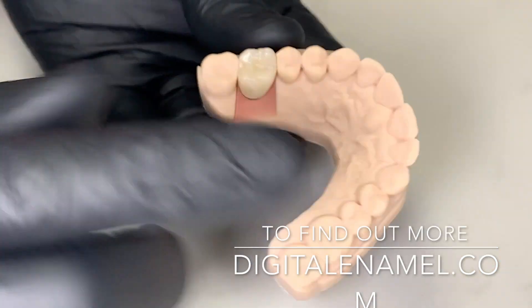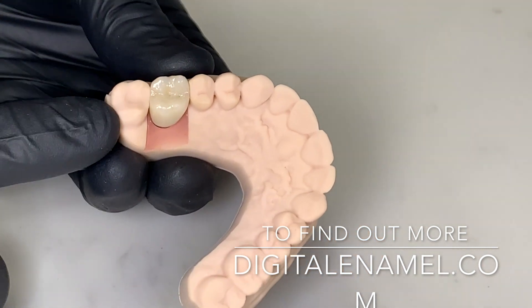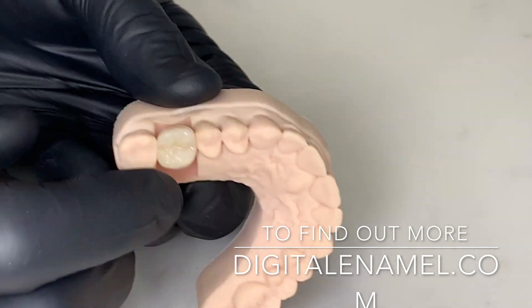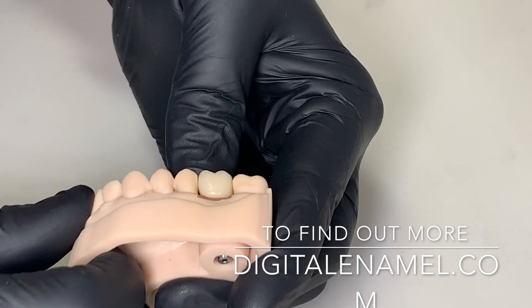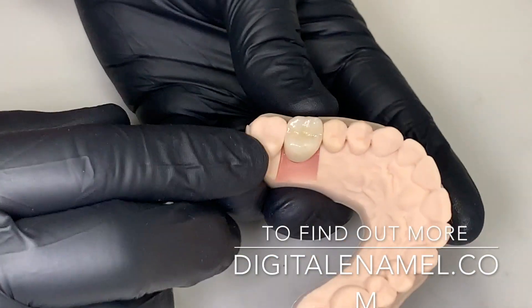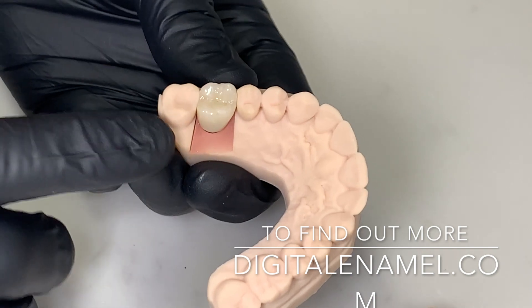So here you go — this is a conventionally cemented crown. In the video I showed you from the 3Shape lab case, it's a screw-mentable type that has a hole. But pretty nice and easy stuff. It really gives you control of your restoration if you are milling these in-house as a two-appointment procedure.